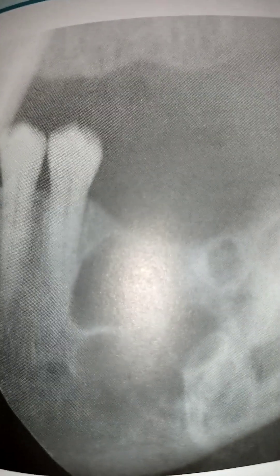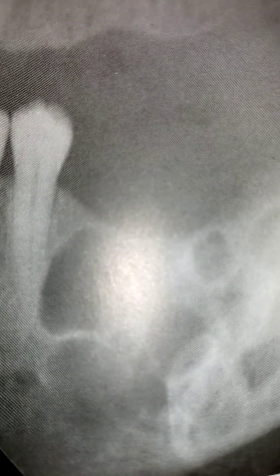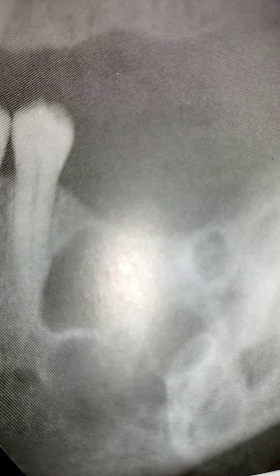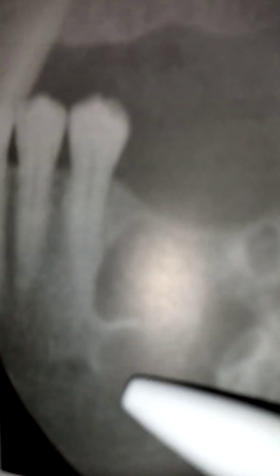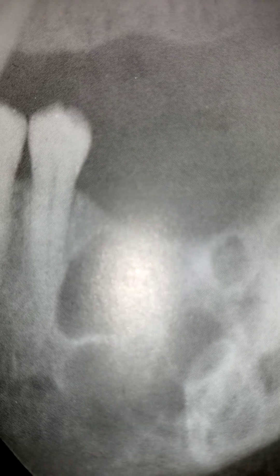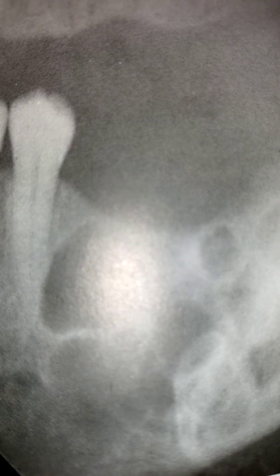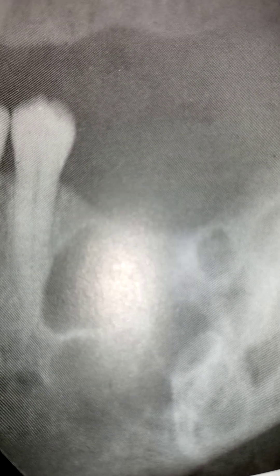The mandible accounts for about 75% of cases, predominantly found in the premolar and molar region. It grows around the tooth, sometimes appearing multilocular radiographically, and spreads extensively along narrow spaces before expanding the jaw.